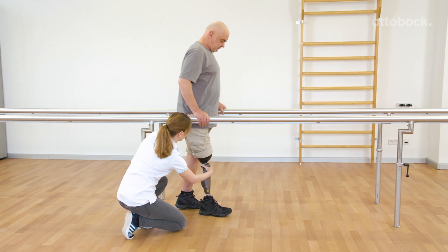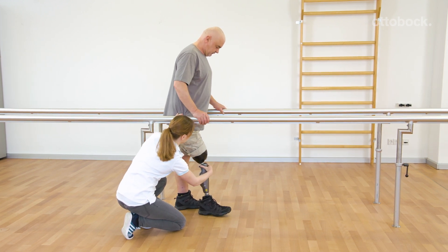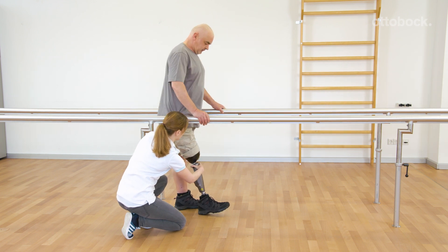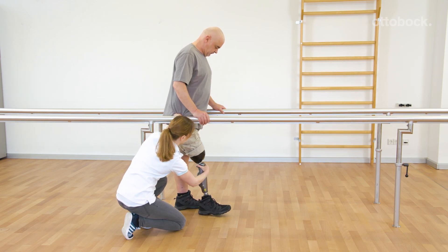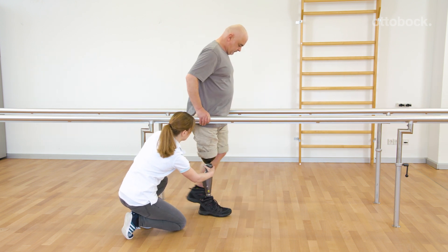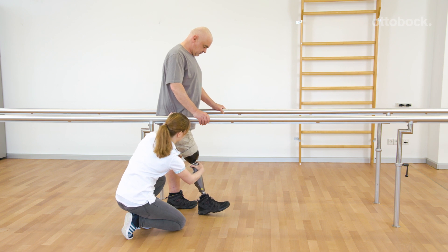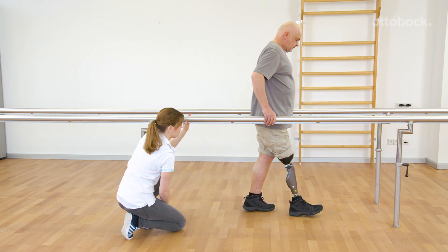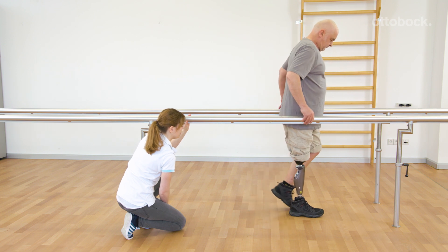Step by step, Franziska and Gerhard develop the sections of stance phase and the transition to swing phase. Gerhard learns to allow knee flexion and to shift his center of mass over the prosthetic foot. This pattern causes knee and hip extension in terminal stance and is a basic prerequisite for stance release.